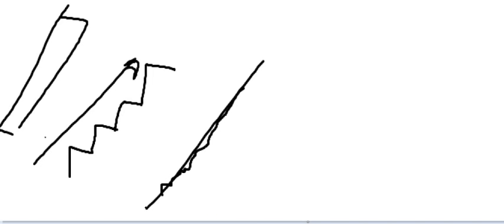But if there was a stone, for example a very small 1 millimeter stone, you will be able to see it if your slice thickness is 1 millimeter. If your slice thickness is 10 millimeters, and you have, say, 2 stones, each 2 millimeters, in one 10 millimeter slice, you'll see them as one stone. You cannot see less than your slice thickness. And you cannot produce a slice thickness less than your detector width. Okay?